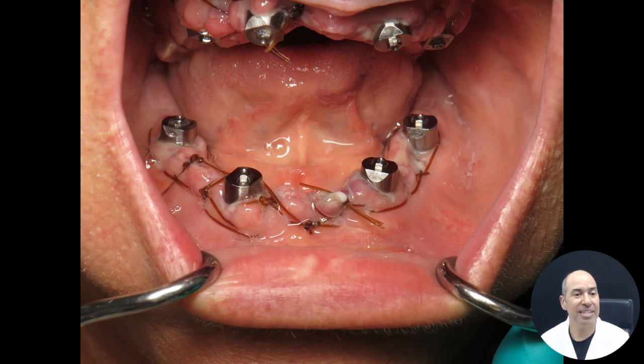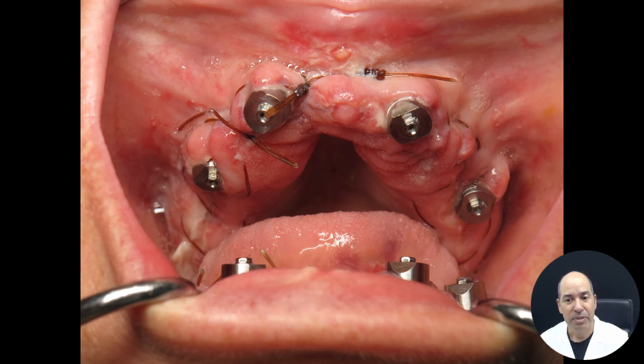So this is what things look like the very next day. Her teeth were made overnight. So we mill them in a computer mill, kind of like little robots that cut the teeth. And this is made that way with my lab designer.